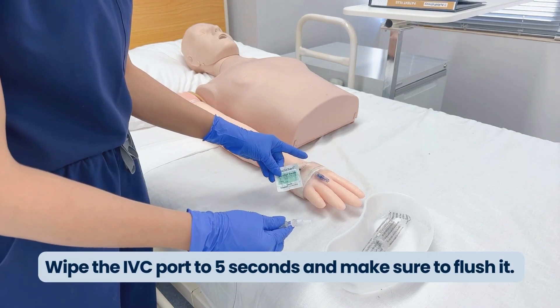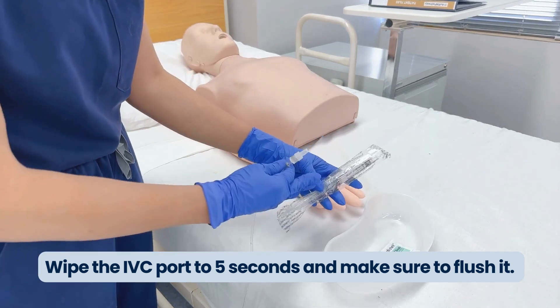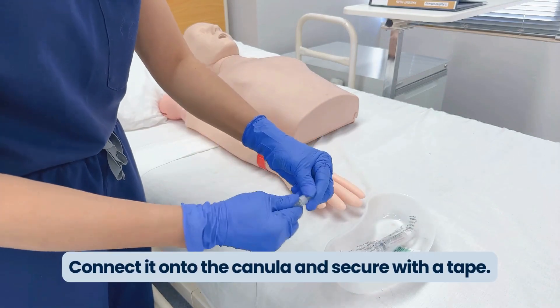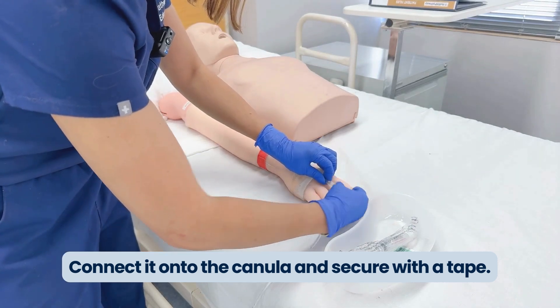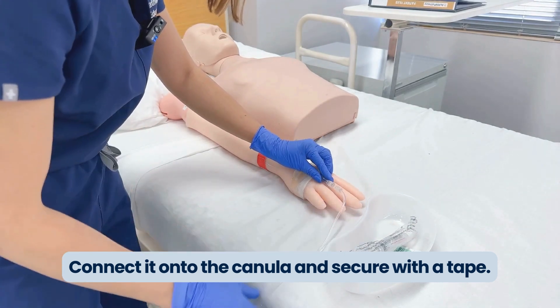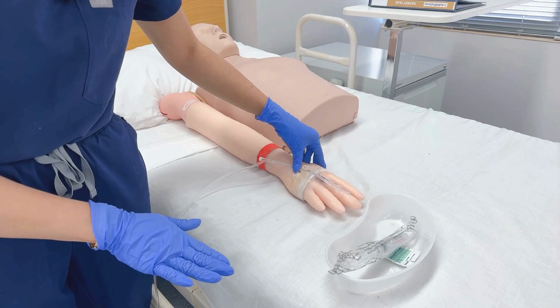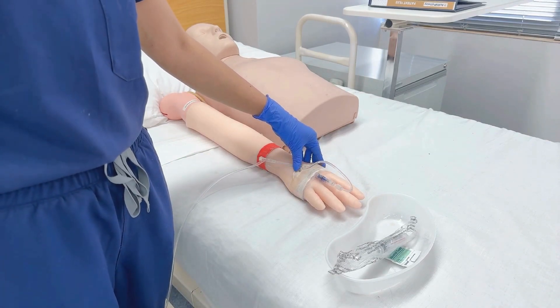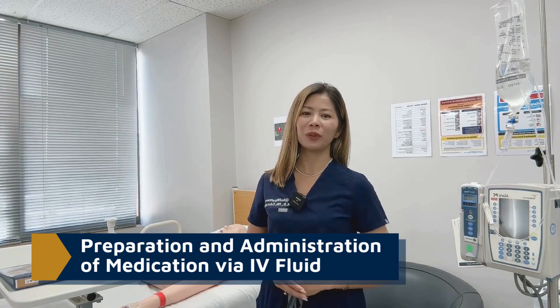To administer, make sure that you are wiping the IV cannula port first with an alcohol swab for five seconds, then flushing it with a positive flush or normal saline. Connect it to the patient's IV cannula and secure it with tape. Then regulate it to mils per hour or drops per minute according to the doctor's order.